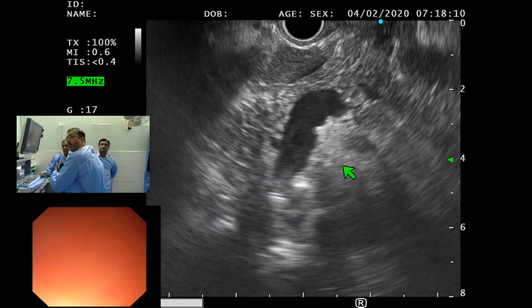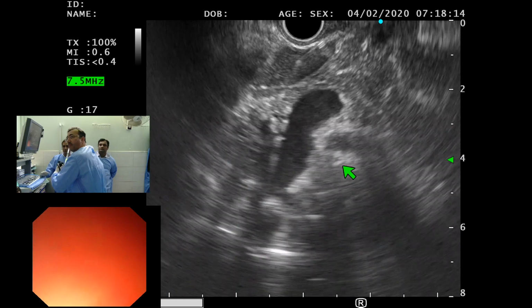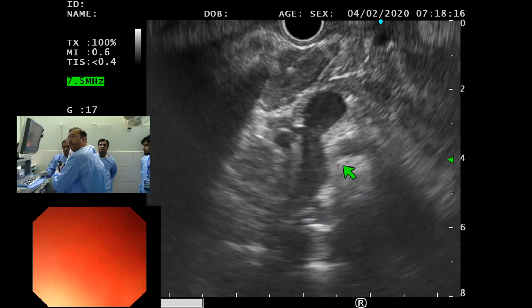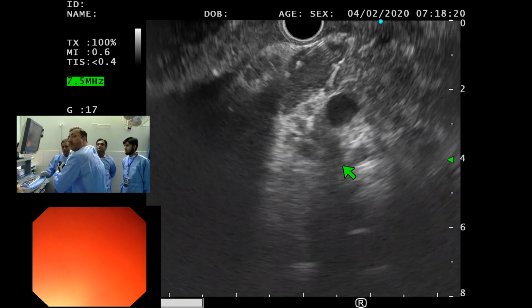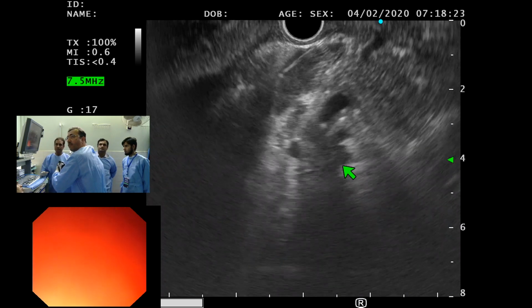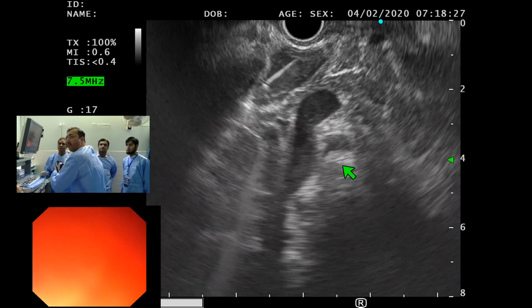Benign lymph nodes, they just follow the normal vascular pattern. Type 1 vascular pattern उसको हम बोलते हैं, that is you see the vessel coming from the hilum and then it is dividing into tiny branches, but the pattern is not accentuated or the branches are not dilated. That is basically seen in lymphomatous or tuberculous lesions.